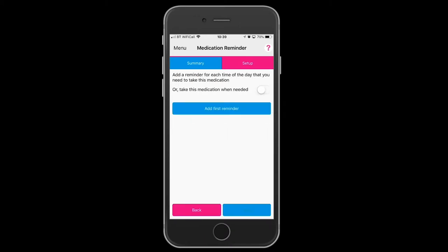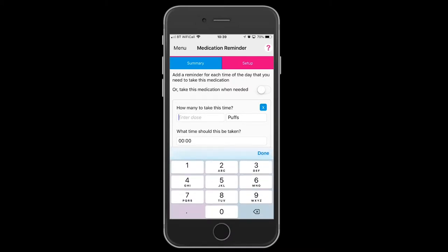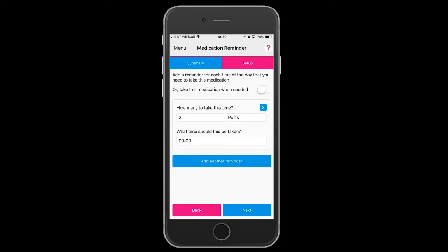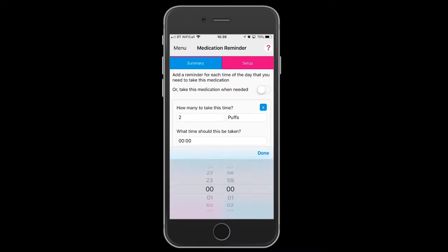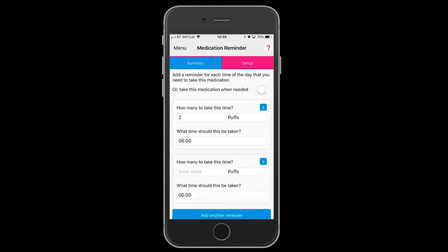Add the first reminder. You can toggle on to take the medication as necessary, or continue to take a recommended number of puffs and a time that you need to take that.